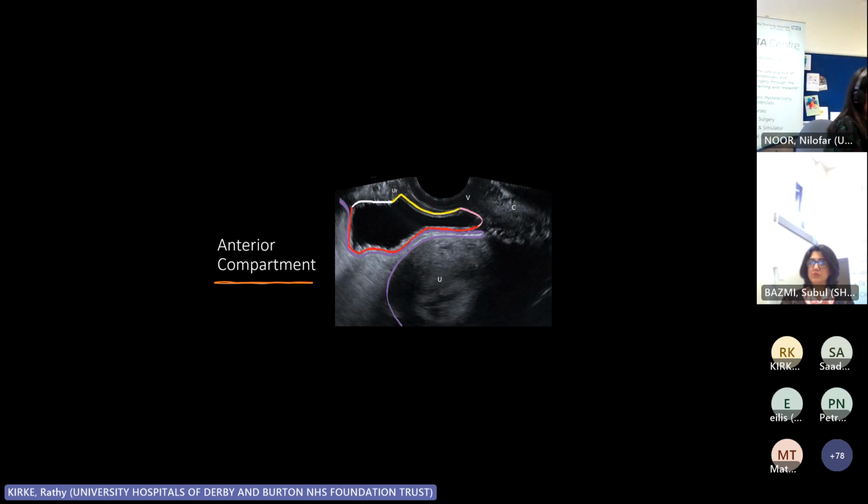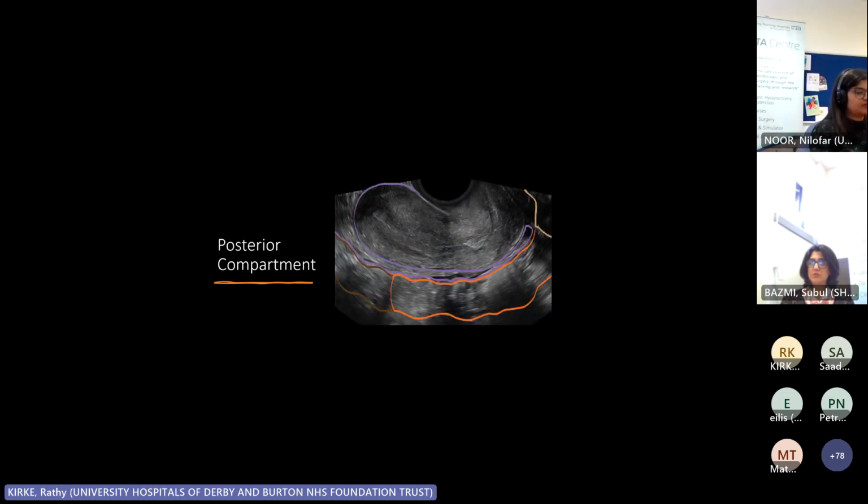When we assess the posterior compartment, it's the same. I think posterior compartment assessment is probably more difficult. This part is what I always look at, the rectovaginal septum. I want to see movement of the posterior part of the uterus relative to the sigmoid and the rectum. I want to see that moving around. You do see deep pelvic endometriosis here on ultrasound if you look for it. It's really a non-specific dark area, but the movement is what really helps. And that's what the IDEA recommend.